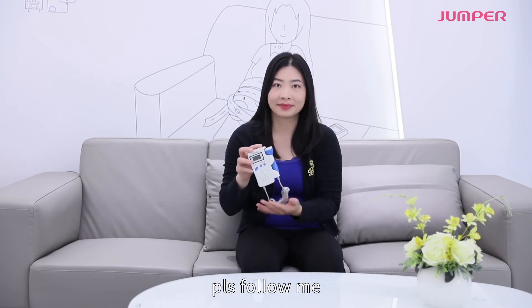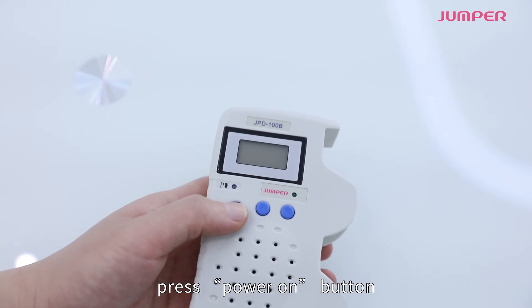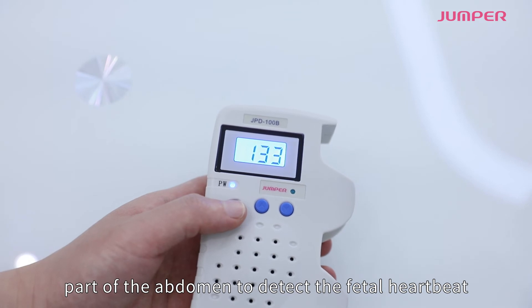To use the device, apply a little gel to the faceplate of the probe, then press the power-on button. Move the transducer slowly over the lower part of the abdomen to detect the fetal heartbeat.